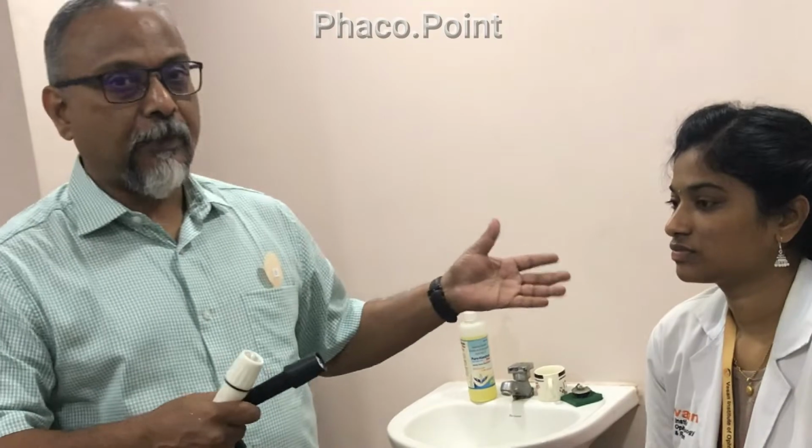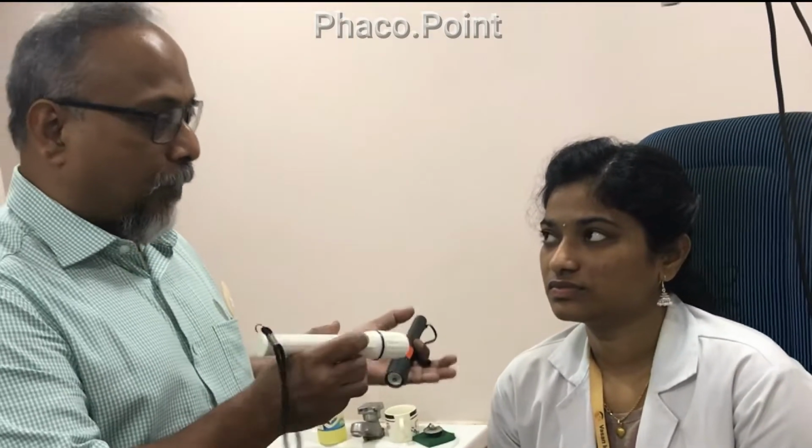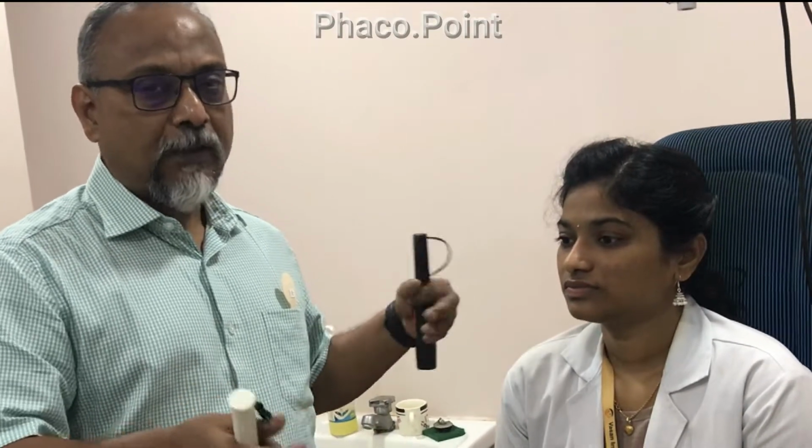Even before you start with the examination in your chamber, it's always a good idea to initially examine the patient, not directly jump into examining the pupils. Before you start, the most important thing is to explain to the patient and obtain consent. Tell the patient that I'll be throwing a bright light, so if you feel a little uncomfortable, you can let me know. When I ask you to look at a certain distance, you keep looking at that same point. Okay? So this is the first step: you get consent and explain the procedure to the patient before starting the examination.